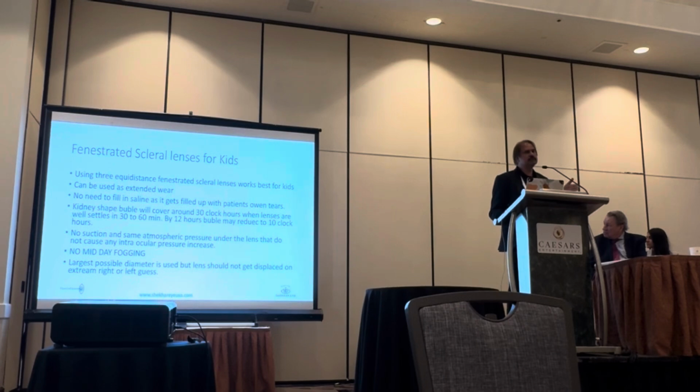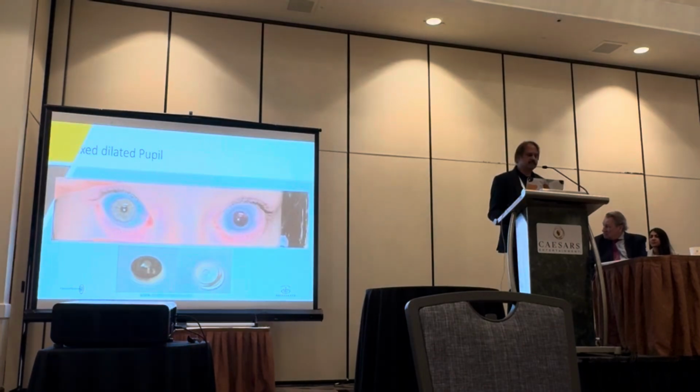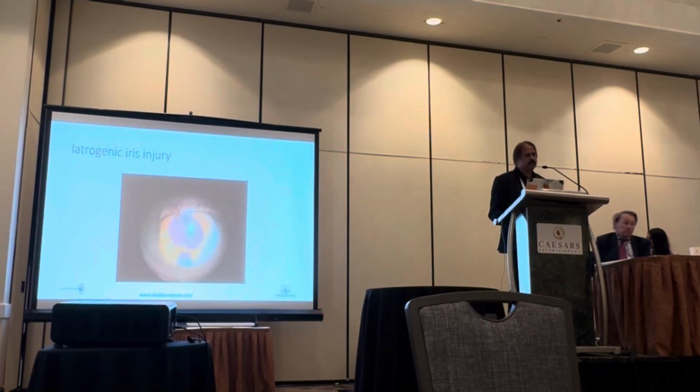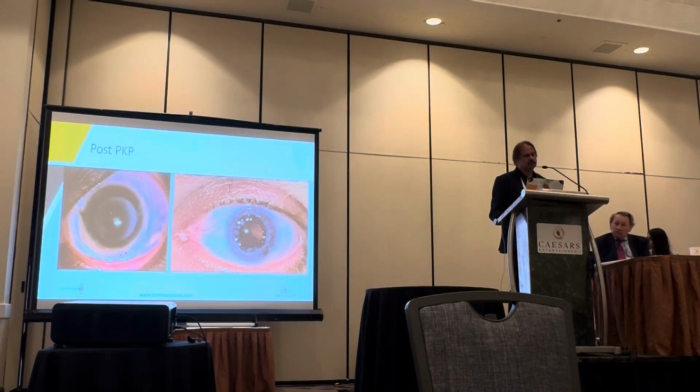Of course, I have not used this type of lens on adults, so I still don't know, but in children, no problem, you just put the lens in and it fills up with the patient's own tears. It can be used on an overnight basis, no need to remove every day. Once in a week you can remove, sterilize and put it back. Fixed dilated pupil patients after some surgical trauma have benefited, as well as traumatic pupils, a lot of patients with injury, iatrogenic or due to accidents.